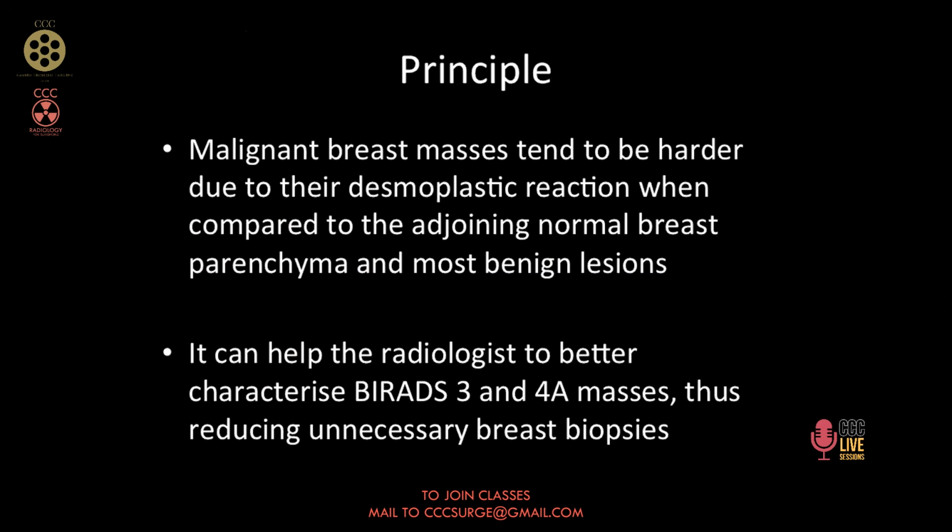So it is not a matter of wisdom to use elastography in every patient. In patients who are having BIRADS 3 or 4A lesions, that means it is between 1% to 10% possibility it can be a malignant lesion, 90% possibility it's a benign lesion, you need to be more careful about that. And in those cases, you can use elastogram.